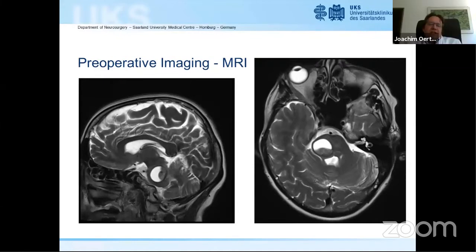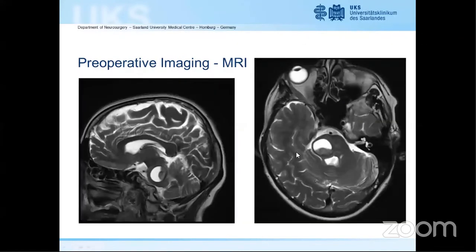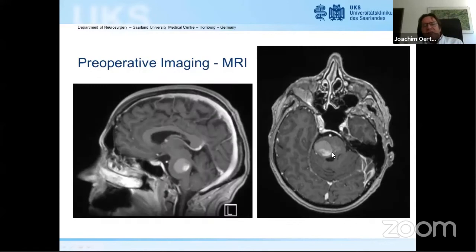I agree. So I'll tell you what our thinking was. First, we don't think it's a glioma. It's too sharply demarcated from the brain. So I think it was either cavernoma with hemorrhage, hemangioblastoma, or hemorrhagic metastasis.